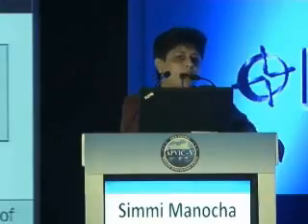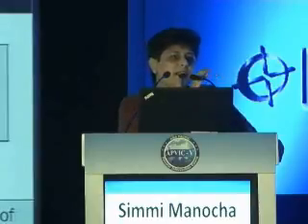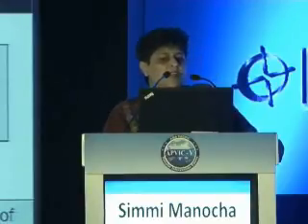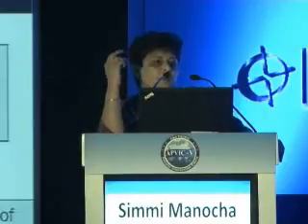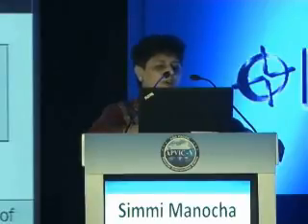Then comes the Doppler, that is, we can use the pulse wave Doppler, or sometimes continuous wave Doppler is also used. In pulse wave Doppler, we put a cursor at a particular point and it gives us the velocity at that particular point. Important is that angle correction has to be used. The Doppler is always to be done at 60 degrees. That gives us the correct information. We will get very wrong information if the Doppler angle is less or more.